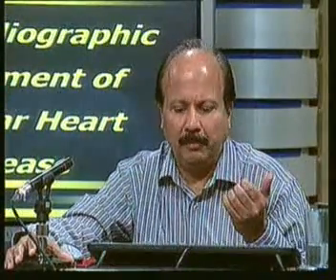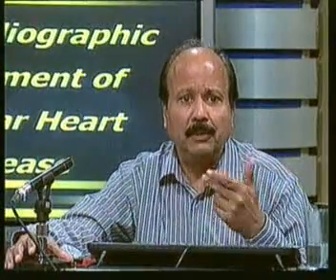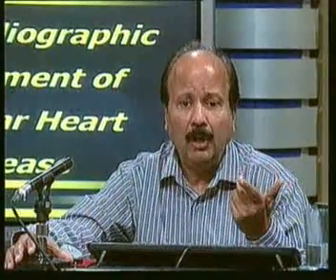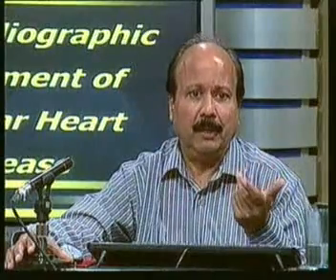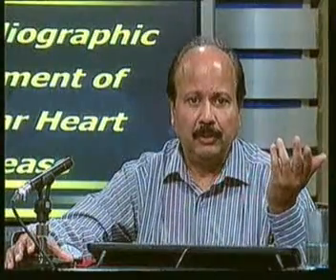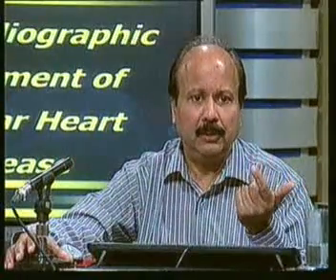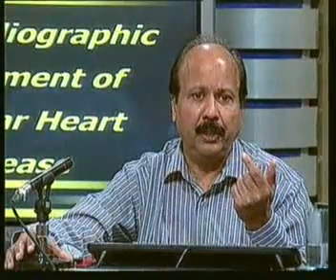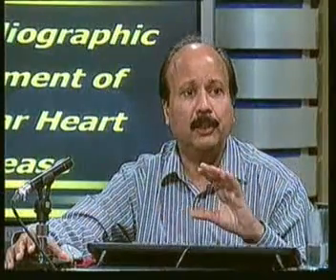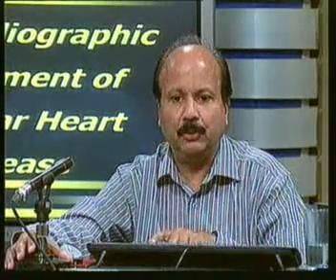It's extremely important. Why is hemoglobin so important? Because many times some disease processes give rise to anemia, like infective endocarditis. Or sometimes anemia makes a murmur more prominent, and you may not find such a regurgitant lesion in actual practice. An X-ray chest, ECG, a good clinical examination, following a good history taking, will give you a very good assessment as to what you are expecting, and then you go ahead and put the transducer on the patient's chest.